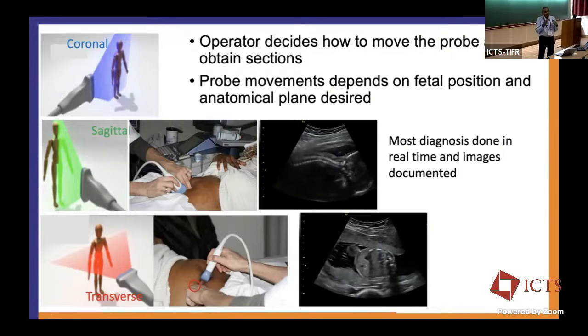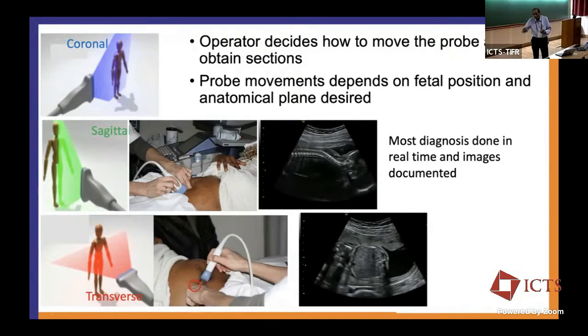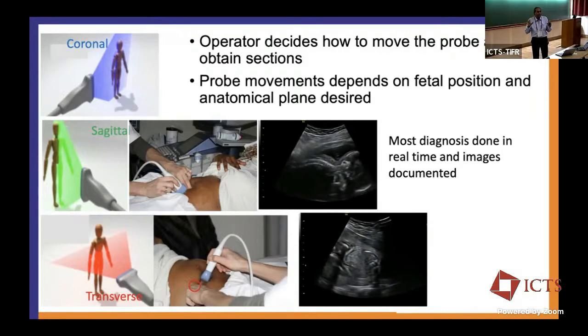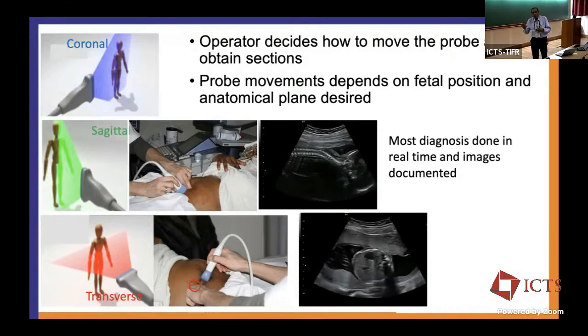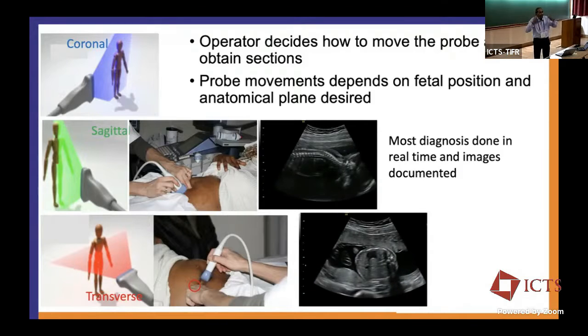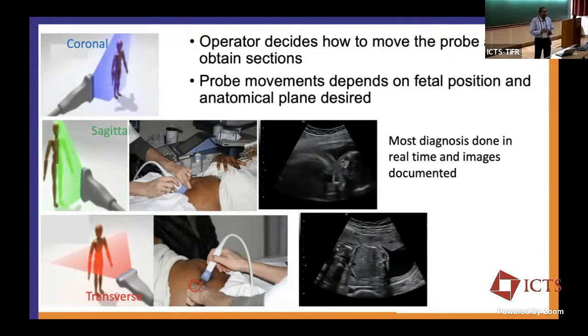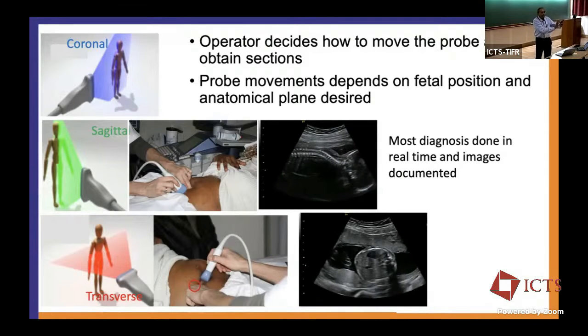If you see the workflow in an ultrasound system, the patient will be on the table, we finish the scan, and the first question the patient will ask is, "Doctor, is everything all right?" Then I have to give her an answer: everything seems to be all right. That means I've already made a decision that everything is all right. So the report is only documentation which I'm going to give.